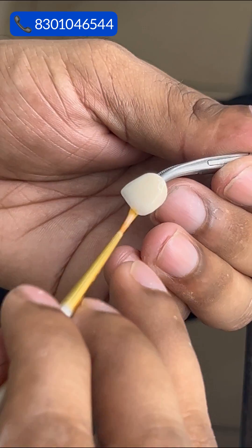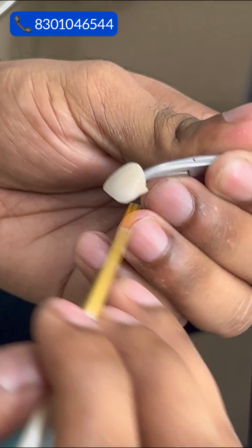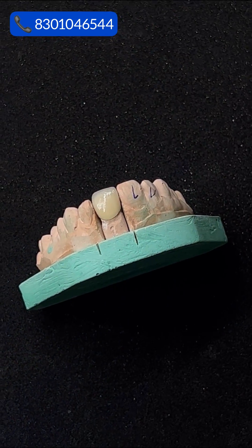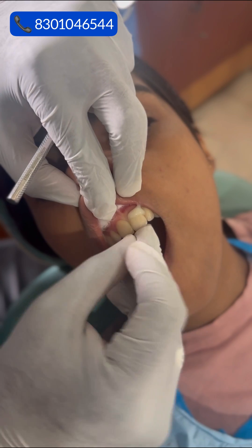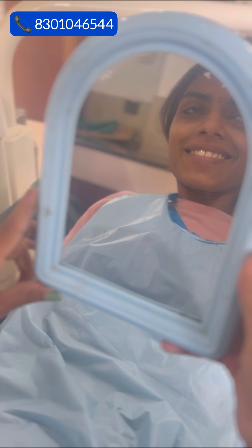Afterward, a glaze is applied, giving the crown a smooth and shiny surface. And there you have it. Our goal is to restore not only the function, but also the confidence of our patients, one beautiful smile at a time.